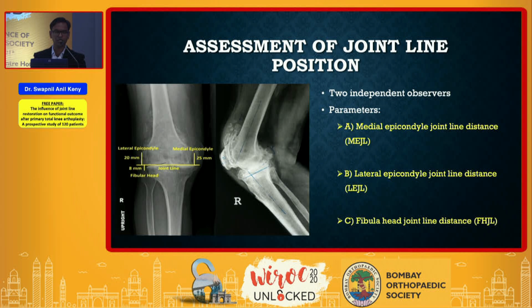consent. Assessment of joint line position on preoperative radiographs was done by 2 independent observers on the basis of anatomical bony landmarks excluding the osteophytes, and we measured the medial epicondyle joint line distance, the lateral epicondyle joint line distance, and the fibula head joint line distance on a standard AP view of the knee, true size with the patella centered to the femoral condyles.